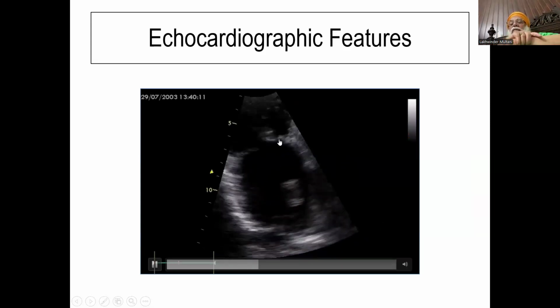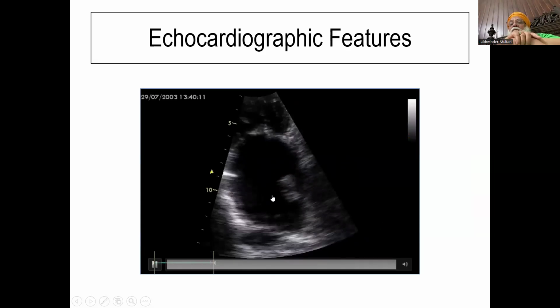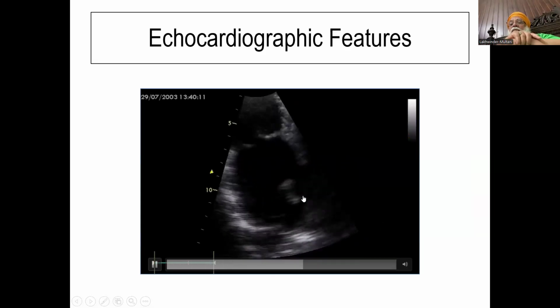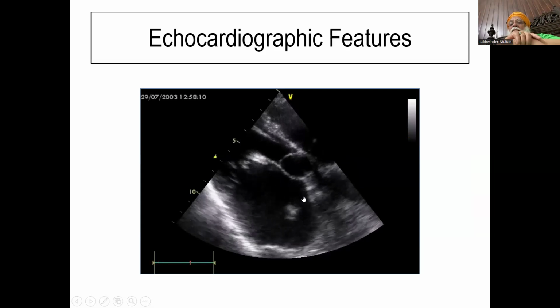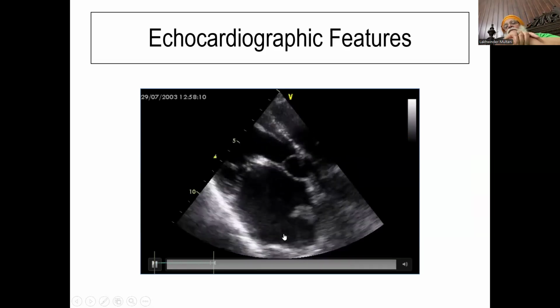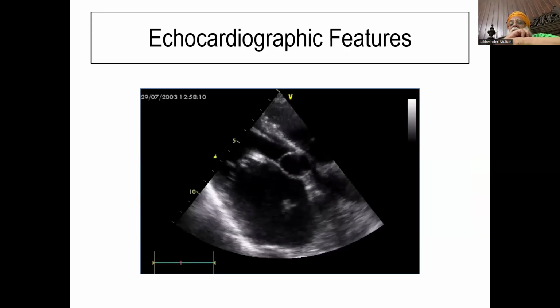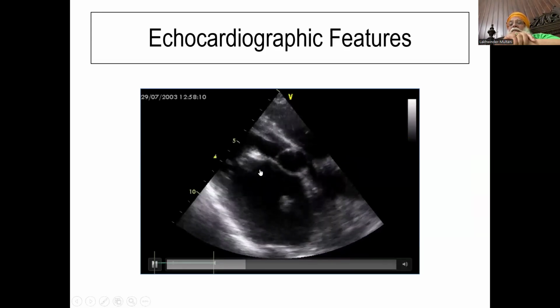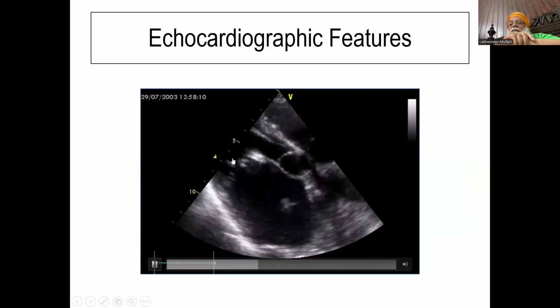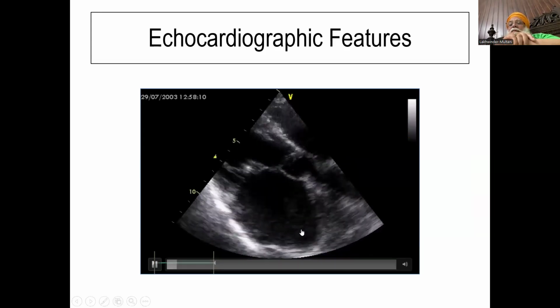And this case of a mitral stenosis shows significant restriction and a clot formation in the left atrial appendage. Now, this clot, which is so freely mobile in this left atrial appendage, many of you will feel that if this gets embolized... when God gives you something, it also gives you something restriction also. Look, the blood cannot get through these valves. How can this thrombus get out of these valves?